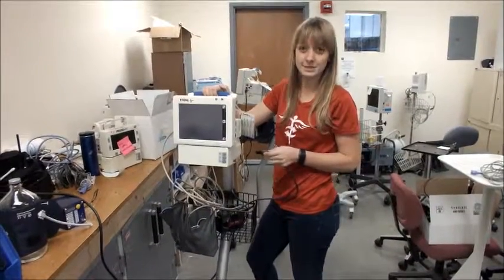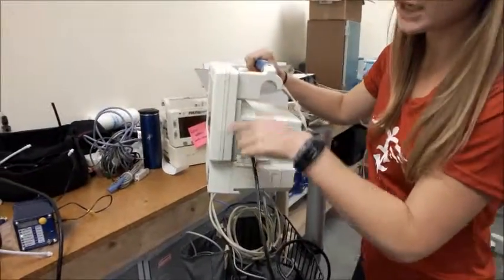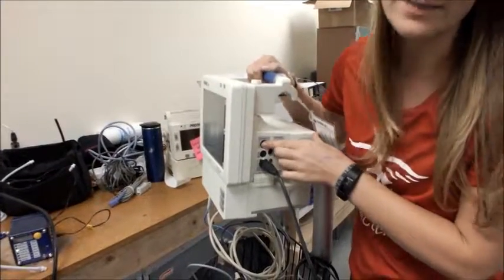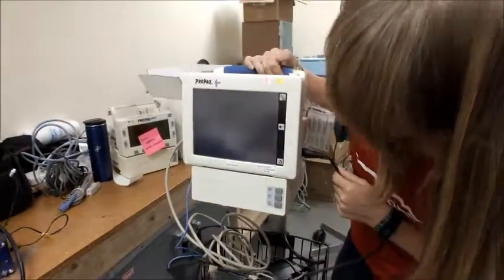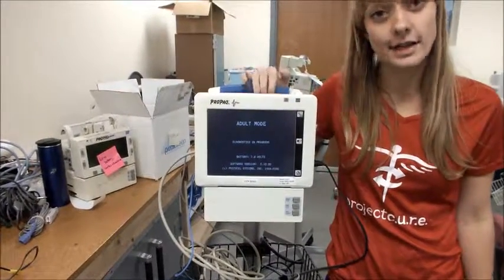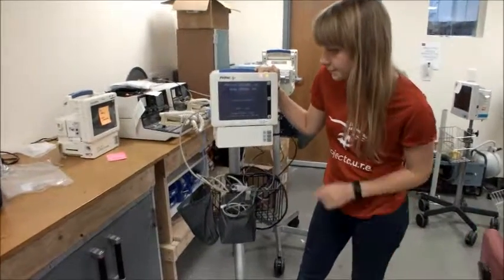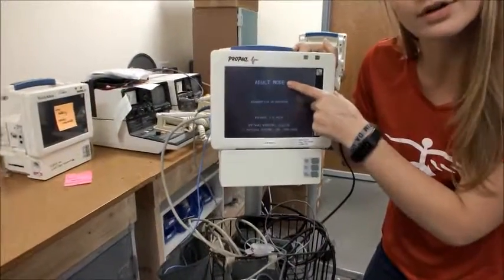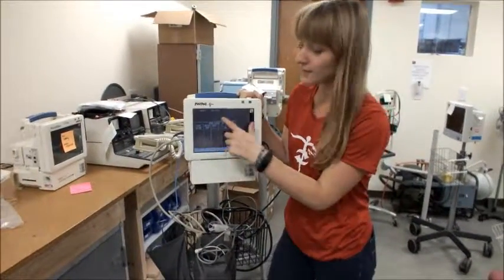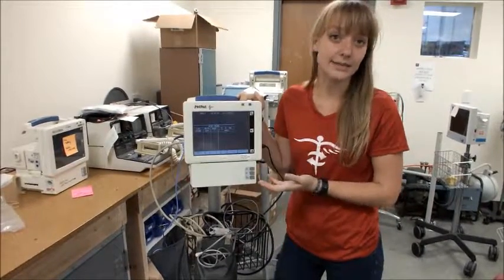The first thing we need to do is check for power. Simply plug in the power cord, ensure that it's plugged into the wall, and hit the power button. If the screen lights up then you're good to go and the machine is working. Notice when the machine turns on it'll say adult mode right here. If it says Neo, Pede, or some other kind of mode, then get help because it's not in the right settings for you to be able to test it.